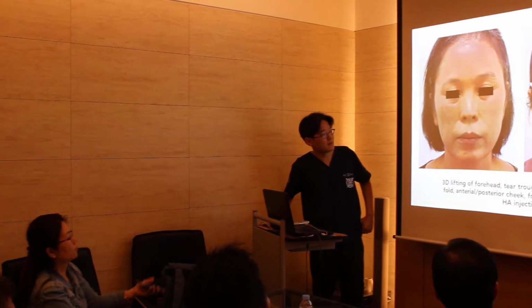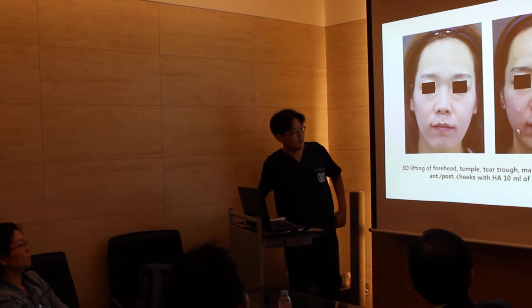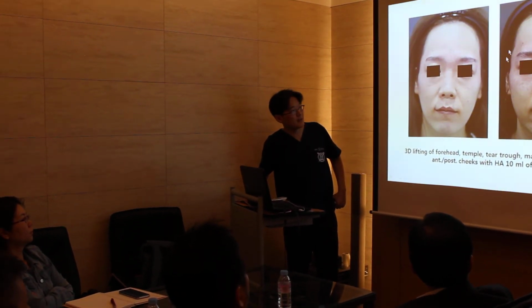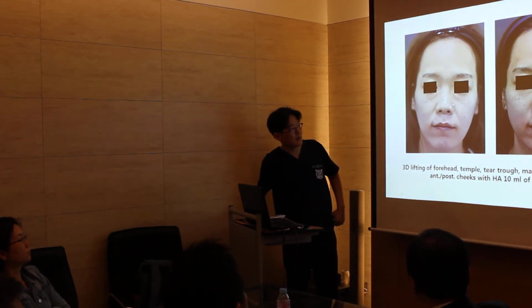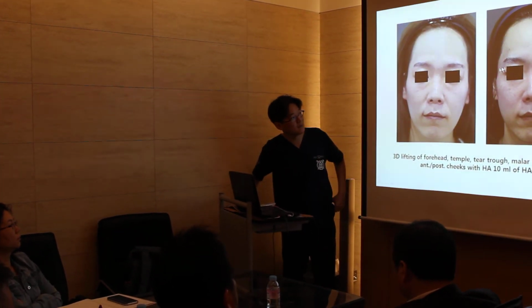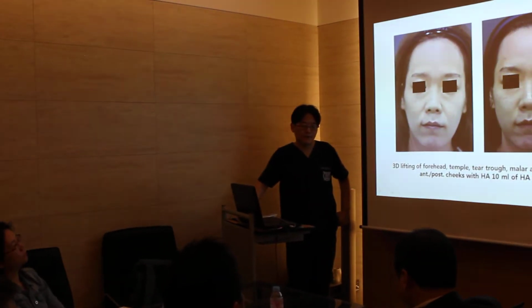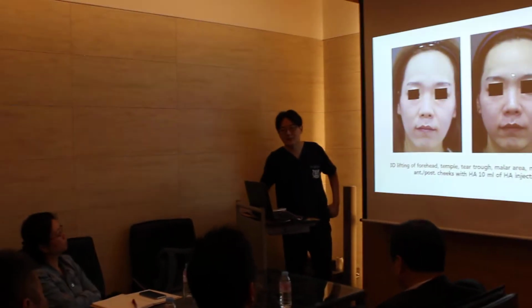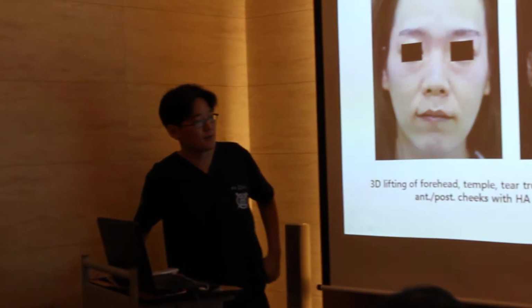So this is my experience with filler injection. After about 10 cc of filler, correction makes the face look younger, because people with sunken areas think they look older and feel ill. So if they get filler here, I think the rejuvenating efficacy is very nice. You can combine filler with other kinds of rejuvenation modalities, including Thermage or Sera or something like that. It's very common in Korea. So this strategy is also common in Korea.